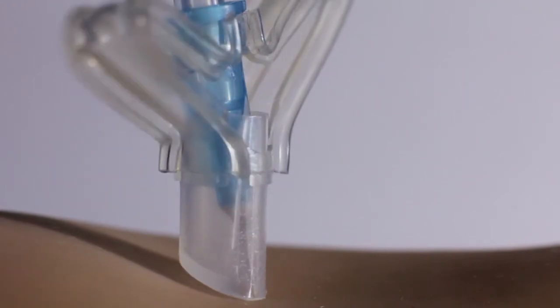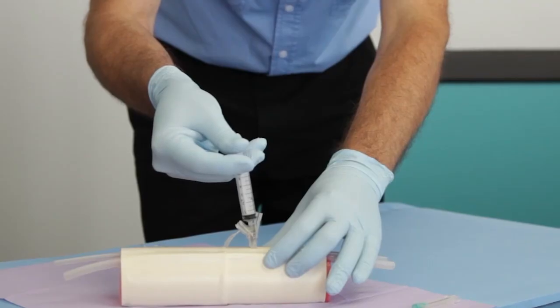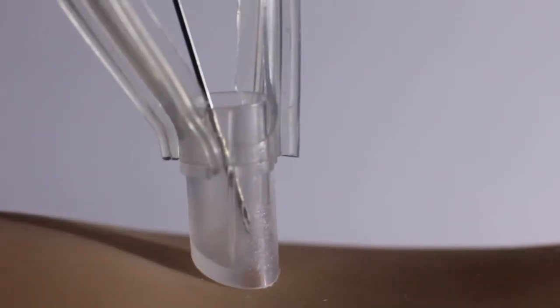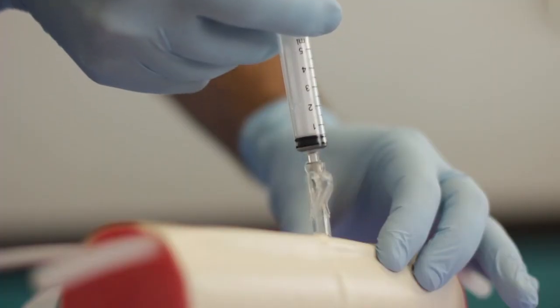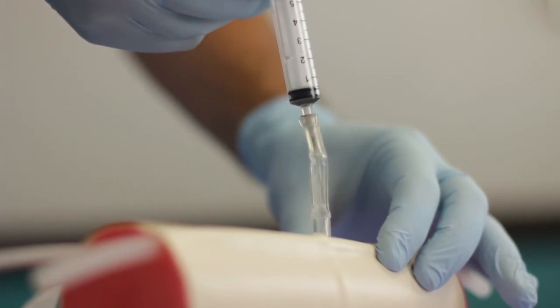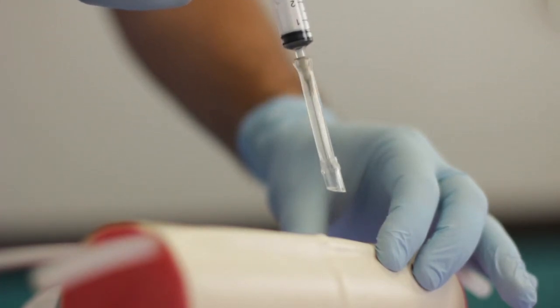Remove your index finger from the safety mechanism. Withdraw the needle. You will notice the reflex mechanism activates spontaneously and passively. The sharp needle tip will be covered by the safety cap in a somewhat off-center position.